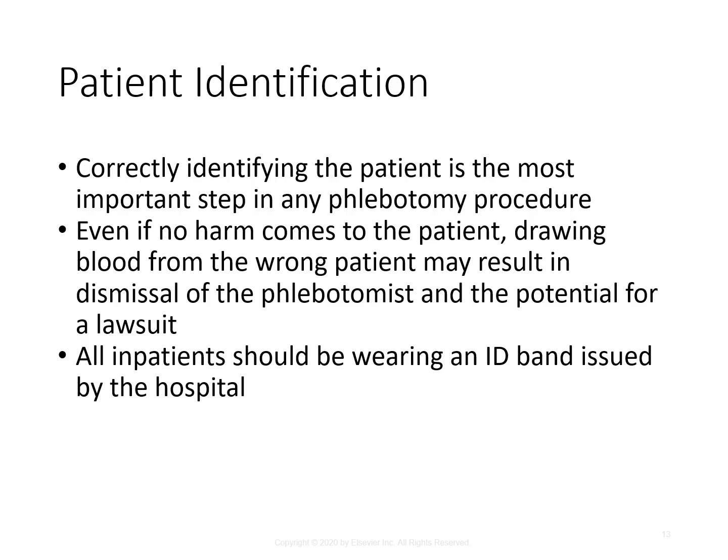Patient identification. Correctly identifying the patient is the most important step of any phlebotomy procedure. Even if no harm comes to the patient, drawing blood from the wrong patient could result in dismissal of the phlebotomist and the potential for a lawsuit. All inpatients should be wearing an ID band issued by the hospital, so that is a good way to check their two identifications. If the patient is able to talk, that's another way as well. Talk to them, check their wristband.